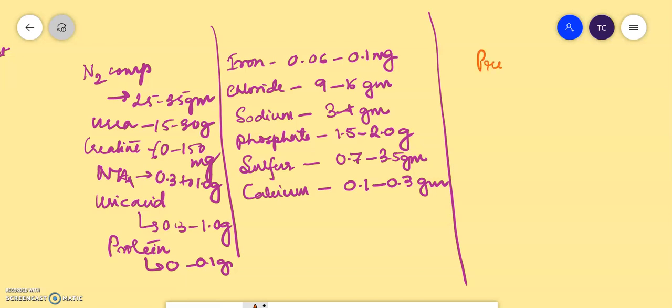Preservation: all the specimens of the routine urine analysis should be examined while fresh, within 1 hour of collection. When urine is kept for longer than 1 hour before analysis, to avoid deterioration of chemicals and cellular material and to prevent multiplication of bacteria, it should be stored at 2 to 8 degrees C in a refrigerator. So if you can store, it's okay, 2 to 8 degrees C in a refrigerator, but better you don't store, because that will result in the generation of bacteria.